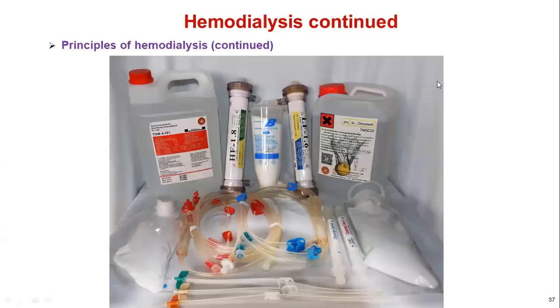So here in this picture, we can see the supplies needed for dialysis, or what equipment is used in hemodialysis.